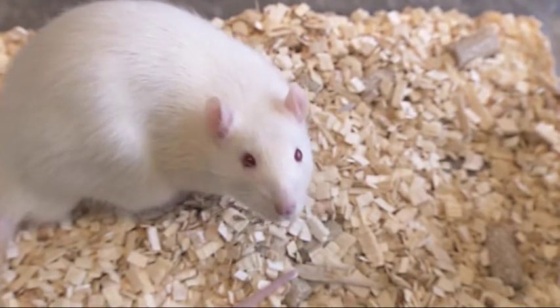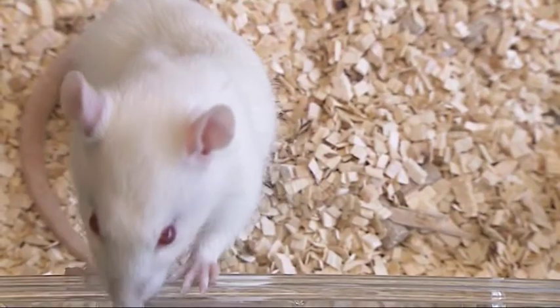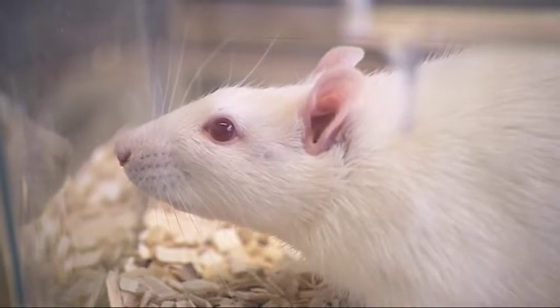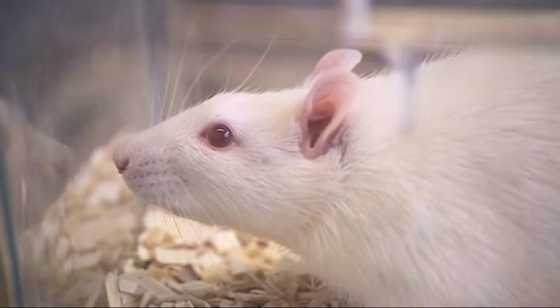The animal's welfare is essential for quality results. A rat in its natural environment is unconstrained in its mobility and curious of its surroundings. When sampling blood, it is important that the animals are as unaffected as possible, especially if you want to measure substances that are affected by stress hormones.